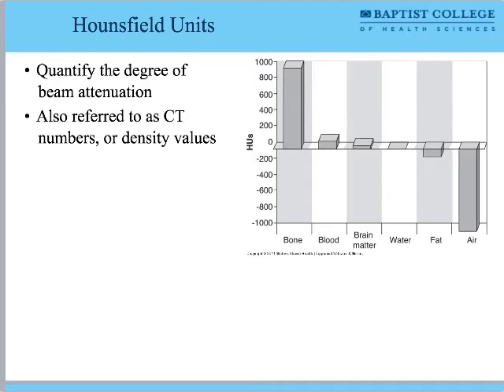It's because we've administered IV contrast. So when we inject a patient with IV contrast, there's going to be more attenuation happening inside of organs that have a lot of blood inside of them, right? And so we would expect to see the Hounsfield units go up.